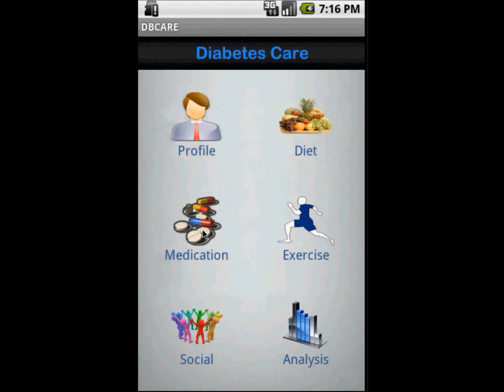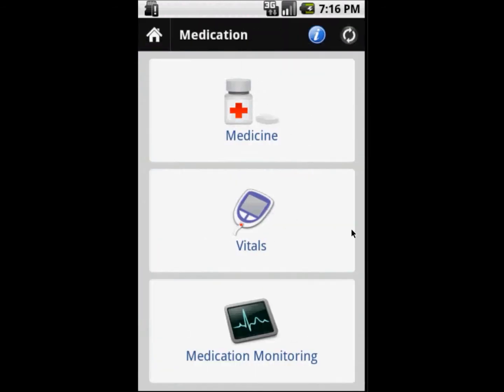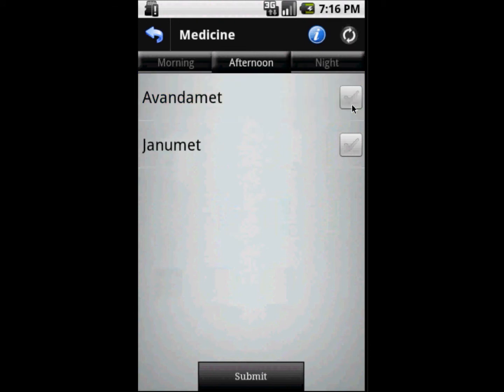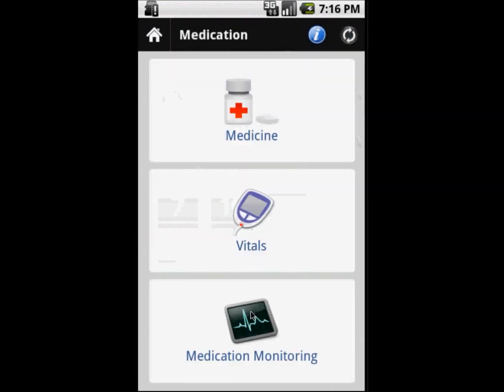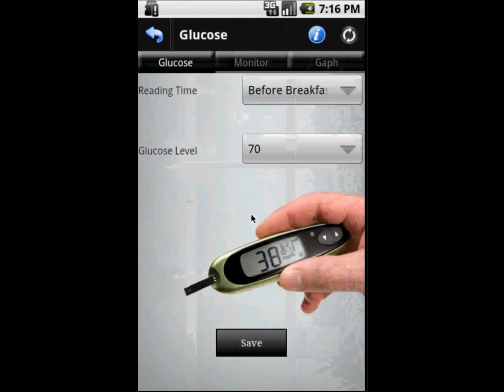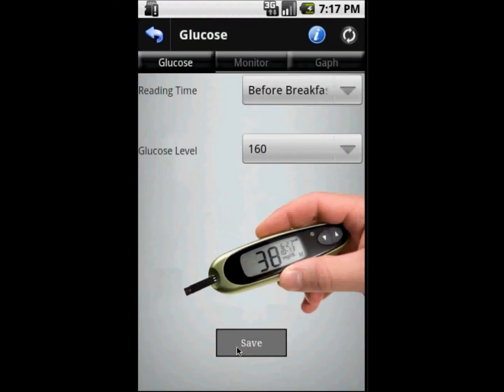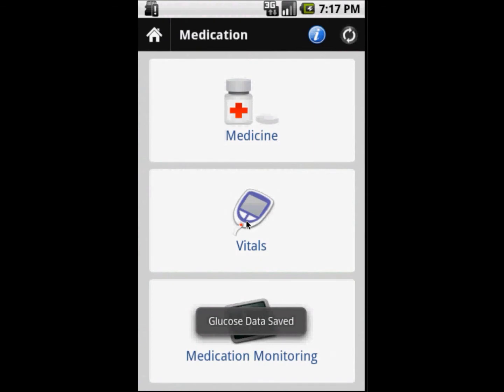Now we move on to our medication module. Here you can take any medicine that has been prescribed by the doctor — you click that medicine and it gets checked. When you submit it, that means you have taken it. You can enter the time at which you took it, and also enter your vital information such as your glucose level and the time of day at which you took it. You save that information.